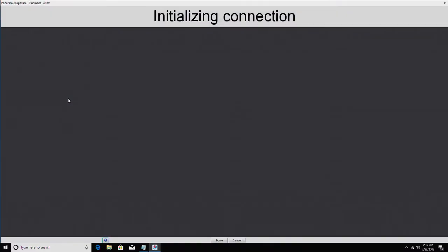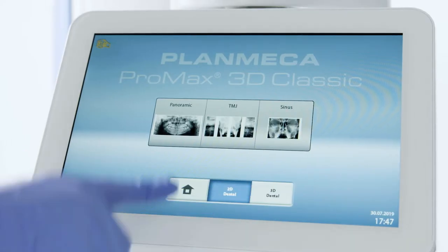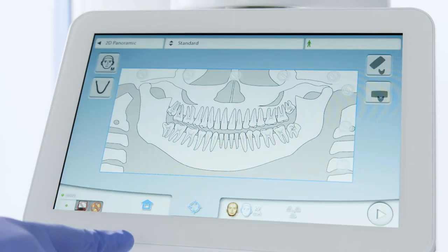Once the computer shows waiting for ready, walk over to the touchpad on the Planmeca Pro Max X-ray unit. Select 2D dental, then panoramic. In the upper left of the touchpad, choose the patient's size.